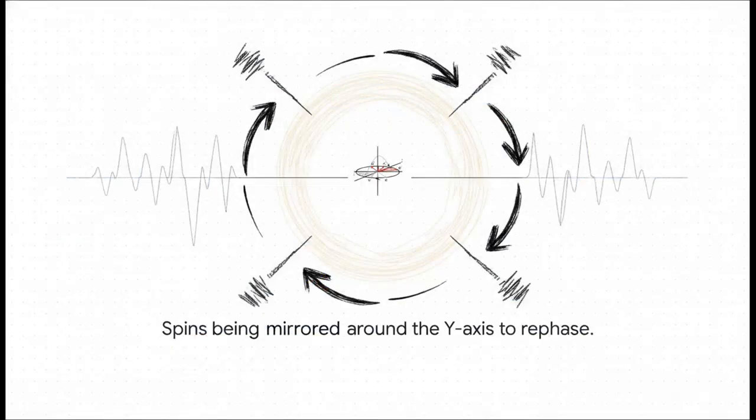And that track analogy brilliantly illustrates the physics happening inside the scanner. That 180-degree pulse literally mirrors the spins around the y-axis. By forcing them to physically flip, the spin echo sequence powerfully corrects for any local magnetic field imperfections. It's actively undoing the dephasing.